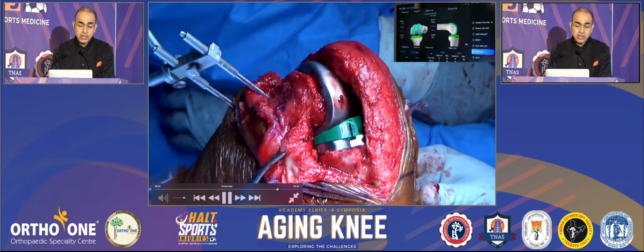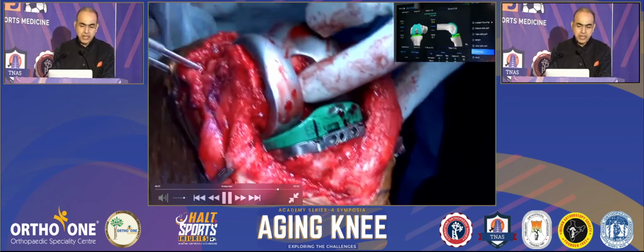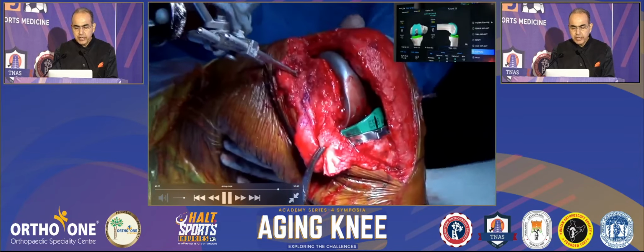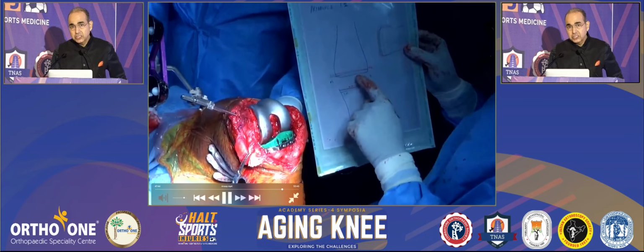And there you can see internal rotation of the tibia on the femur, a beautiful 10 to 14 degrees, and this in turn facilitates patellar tracking. So these are the principles of kinematic alignment, and then the rest is the cementing part. But friends, ligaments are not tight. Our cuts make them tight.